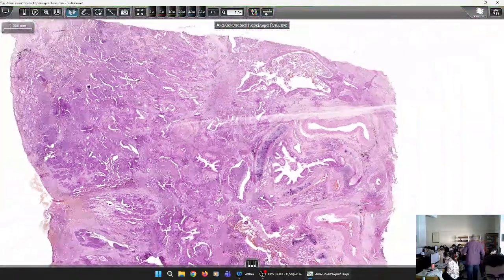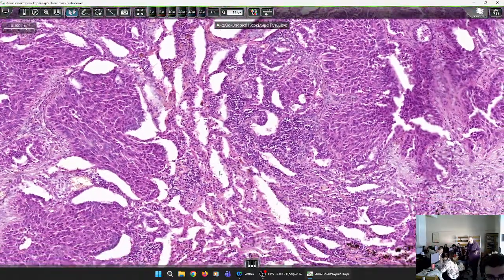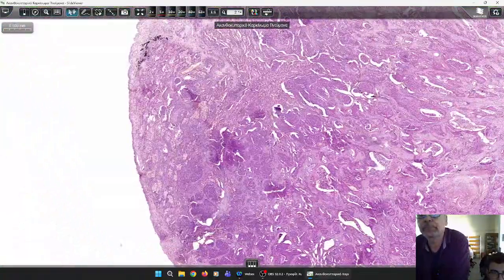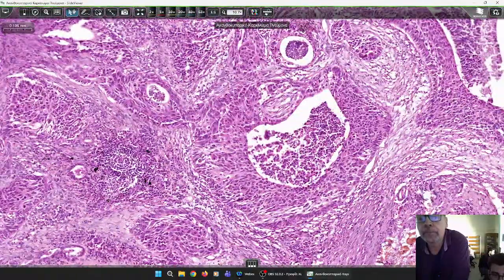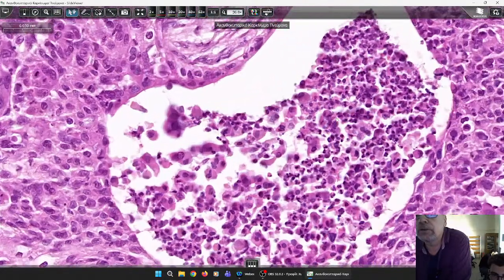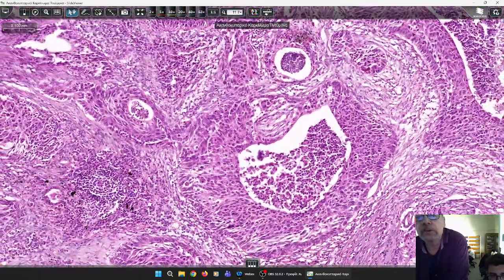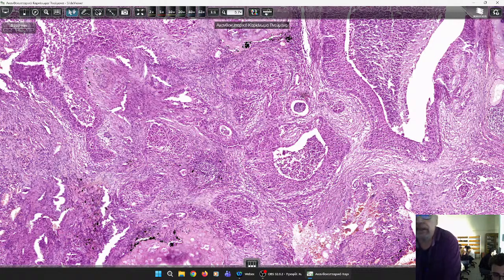Why do I call it dirty? I call it dirty because there are some inflammatory cells in the necrotic material. Let me find again the necrotic area, Theophanis, because you see, here, look. This is dirty necrosis. Why do we call it dirty? Because we have neutrophils within the necrotic material. You see the neutrophils here? Yes. So it is not indicative of adenocarcinoma differentiation.